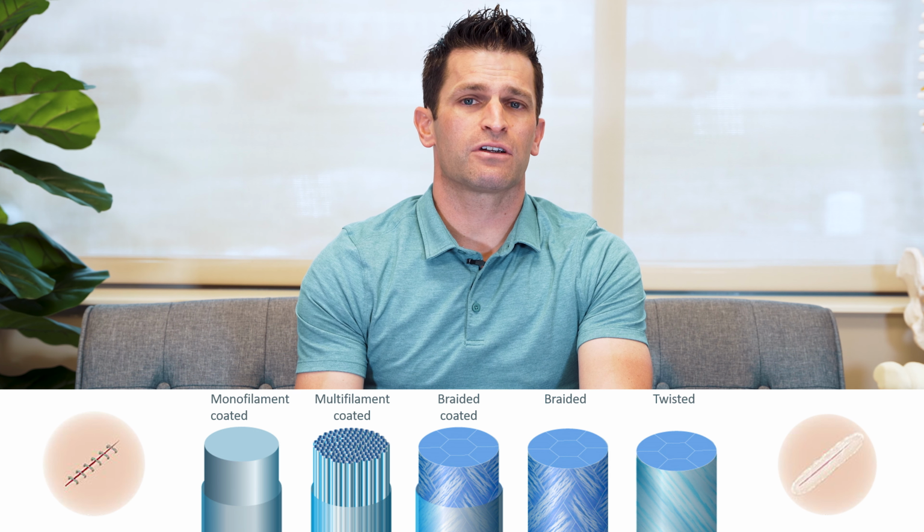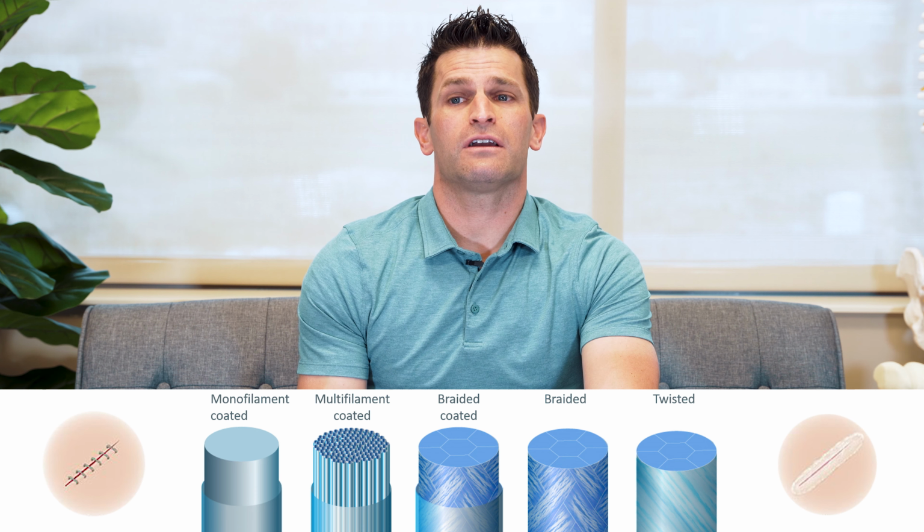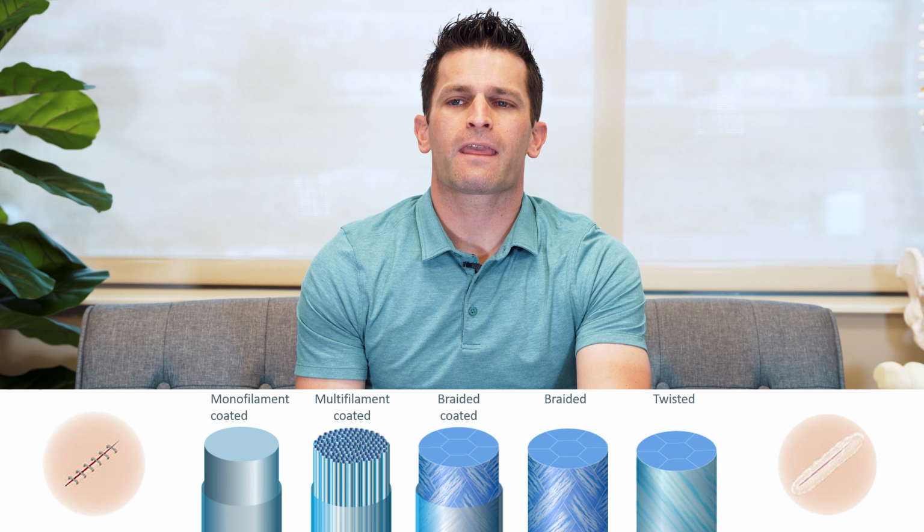Staples are nice because they're efficient, they're easy to remove, and are really good especially for the scalp and doing a craniotomy. The monocryl suture is a thin little fishing line-like suture that you might see that we will sometimes use to help close a wound, especially in the back of the neck and on the head. It absorbs over the course of a few weeks.